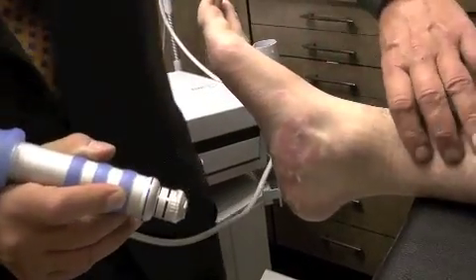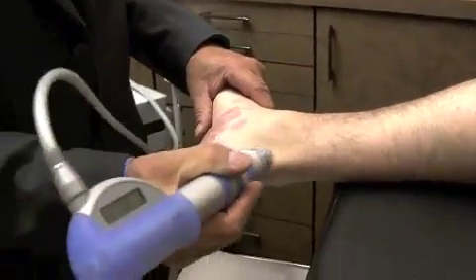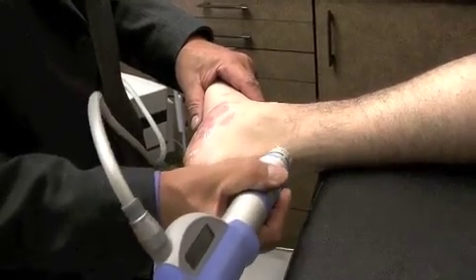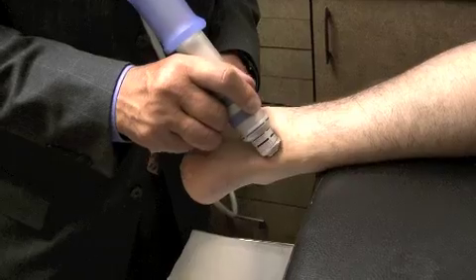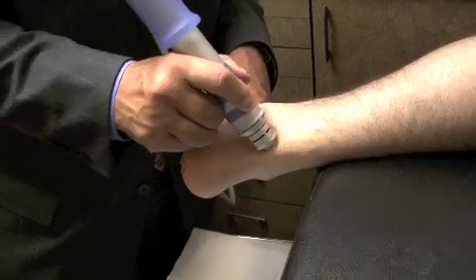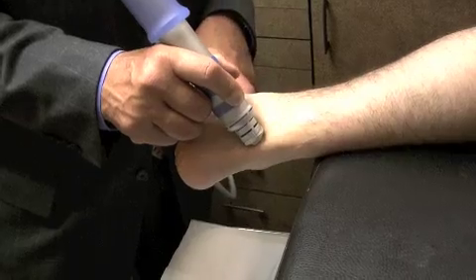Now, if he has pain with his Achilles, we have a couple of different ways we do the Achilles. First of all, the Achilles pain might be up in this area. We're going to start at the back end and go here with it, up and down. And then a real important point, we dig it in from the side here. Herm's going to love this one because this is like that little metal comb he uses. It really blasts away to try to get the undersurface of the Achilles.